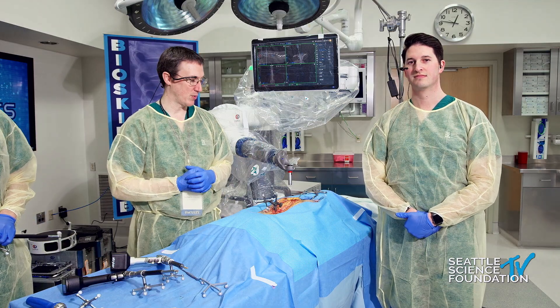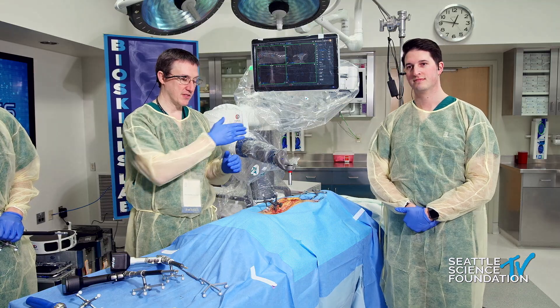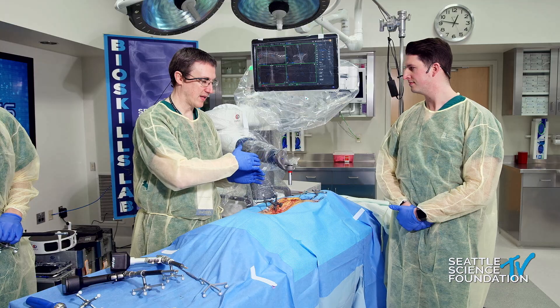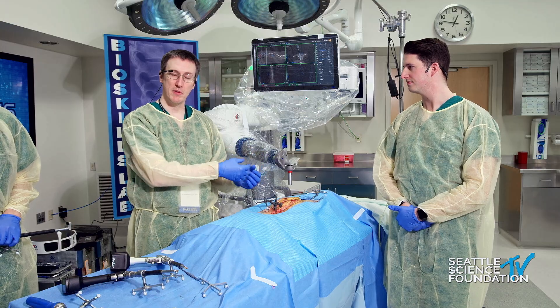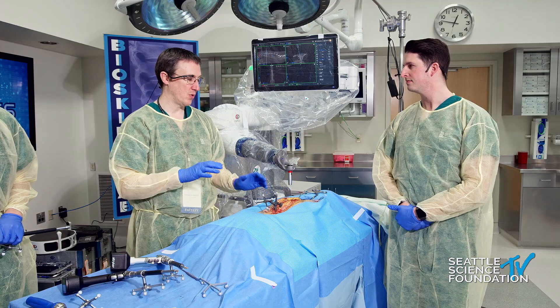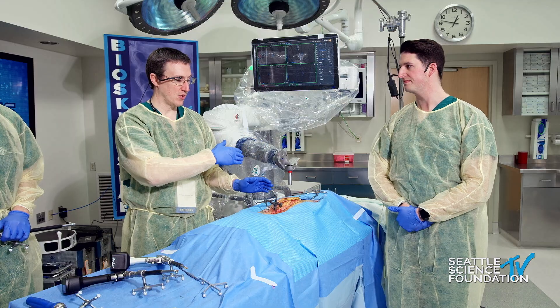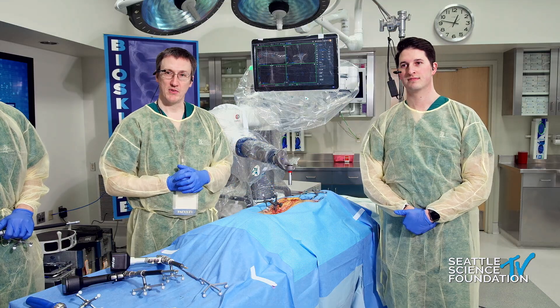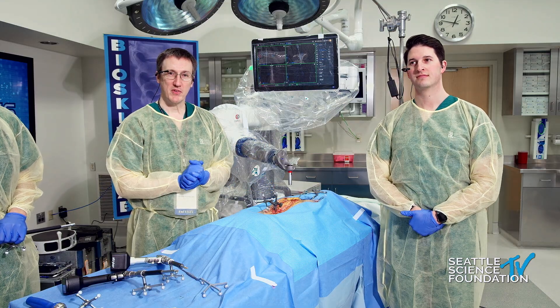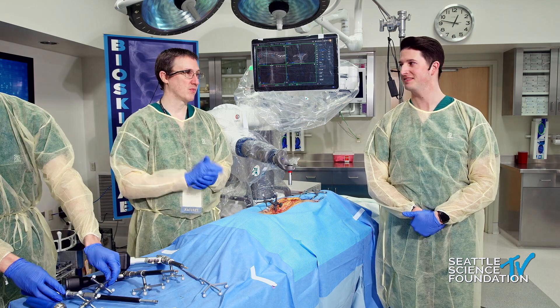It's helpful to build that confidence in the robotic platform. It's imperative that you be cognizant of the fact that as you're doing these maneuvers you're manipulating the spine underneath you — that effect will be exaggerated the more cephalad you are away from your array. So it's nice to start at the top and work yourself down in a weaving pattern to compensate for that. I imagine everybody's hungry — I'll take questions during lunch if that's okay with the team.